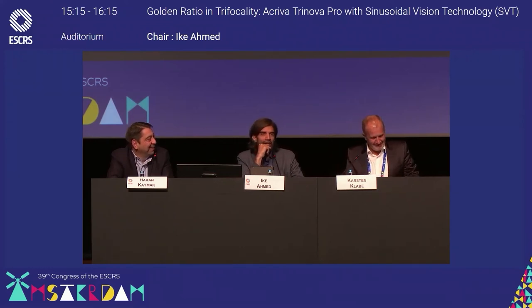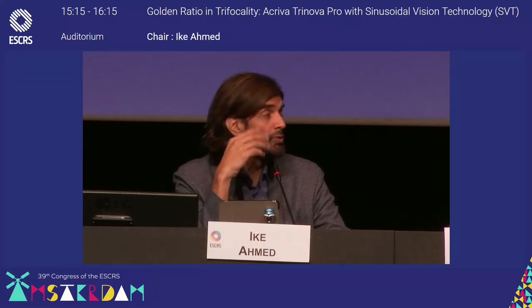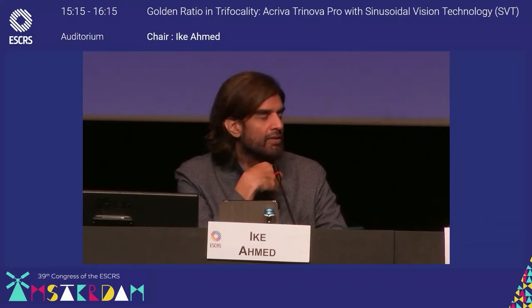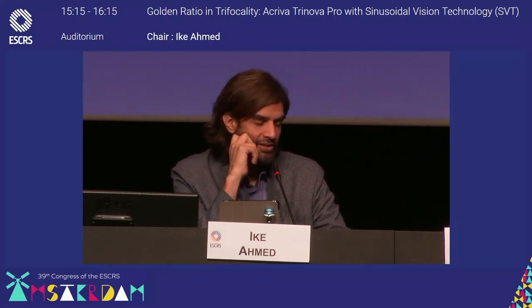I like to use CTRs when I'm putting a toric lens in an axial length more than 27.5 millimeters. I feel that there's better AP apposition of the capsule and circularization of the bag, but I don't do it routinely, to be honest. I think our A constants are pretty good with that. But it's interesting to hear Dr. Klabe's perspective. And of course, if the zonules are weak, then we have to be careful for any of these lenses.